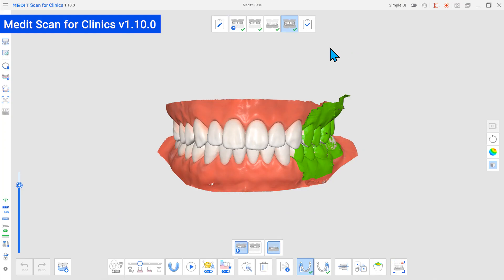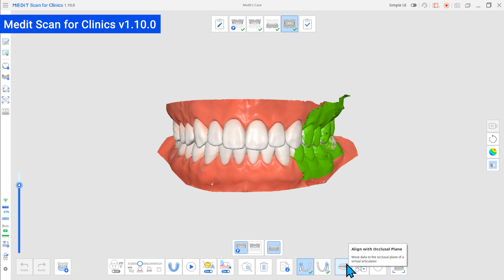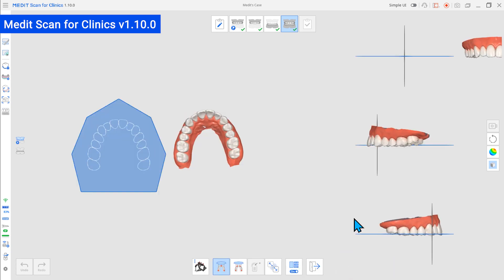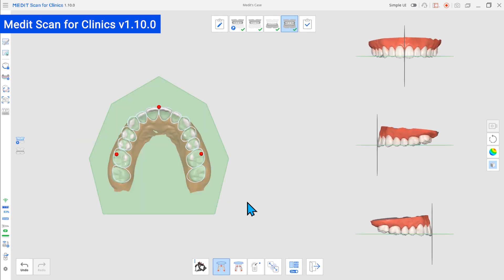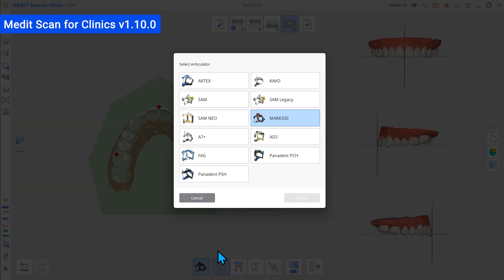After the update, users will be able to choose an articulator type according to which data would be aligned with the occlusal plane. After the occlusal scans are aligned, enter the Align with Occlusal Plane feature where you can select your preferred articulator.